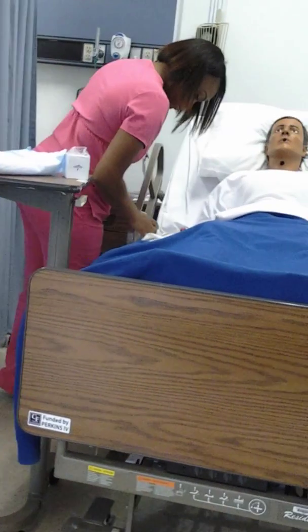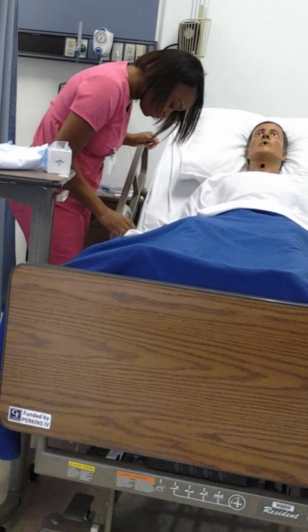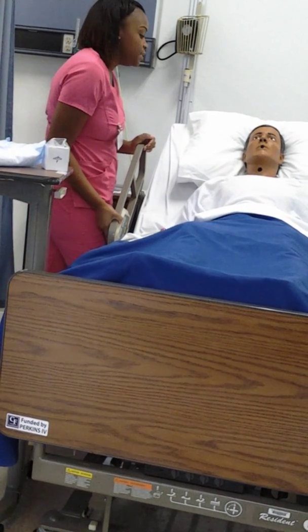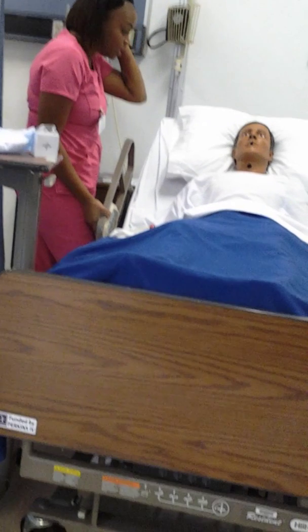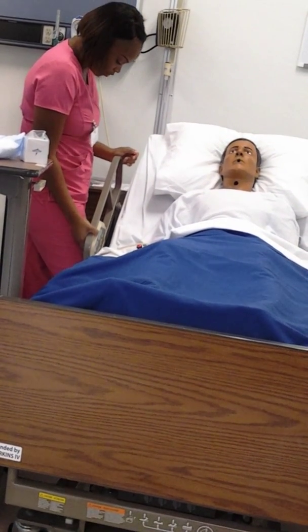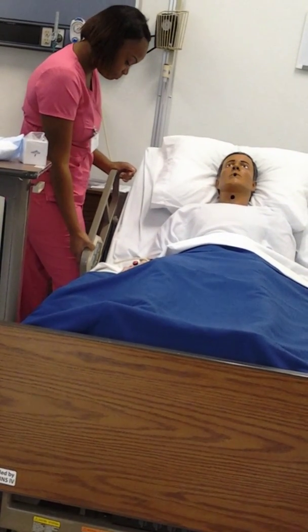I'm going to go ahead and position the patient back down. I'm going to go ahead and put you back down, okay? Now, do you mind staying up a little bit? Staying up this high for a little bit. It'll help you get up those secretions that we just kind of loosened up, okay? Just for about 30 minutes. Is that okay? Yes. Okay. We're going to leave her up for a little bit.